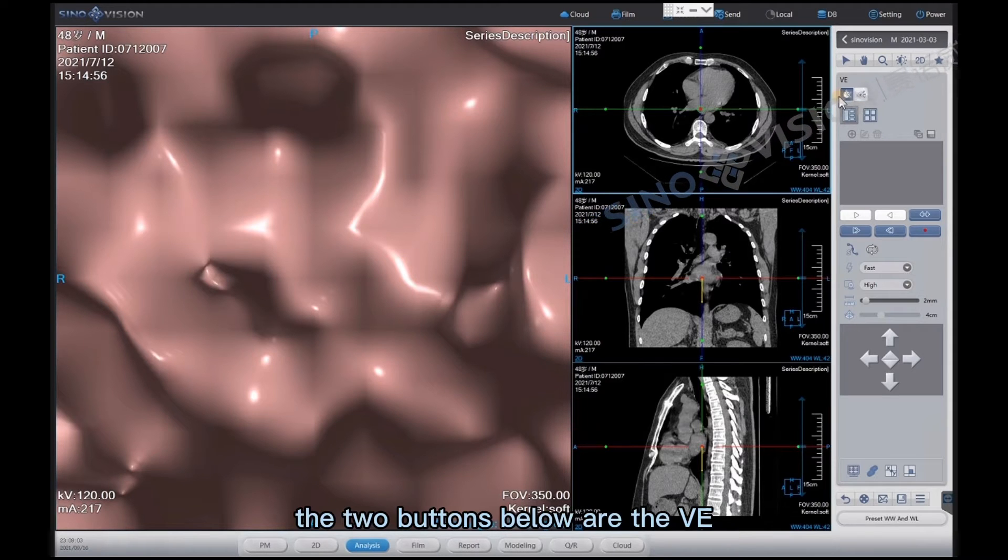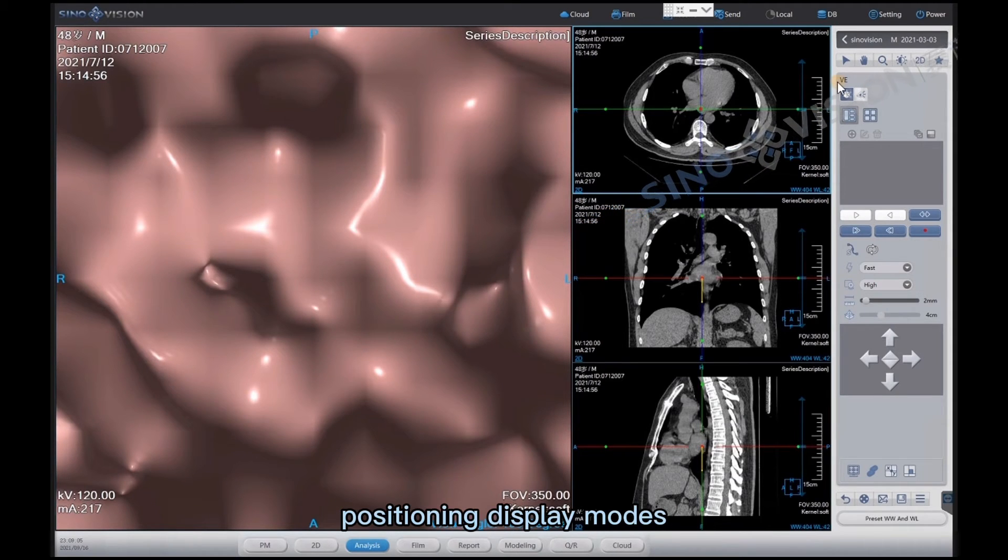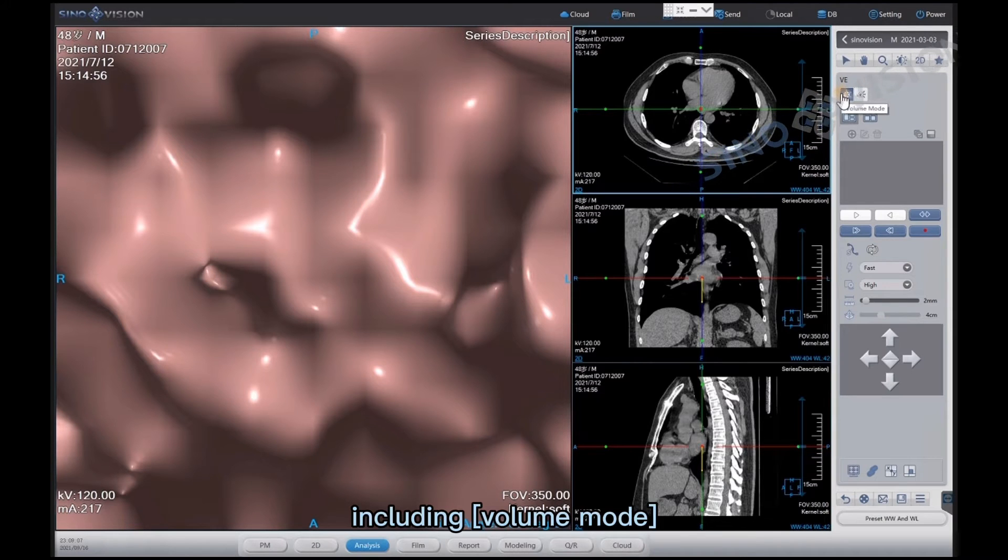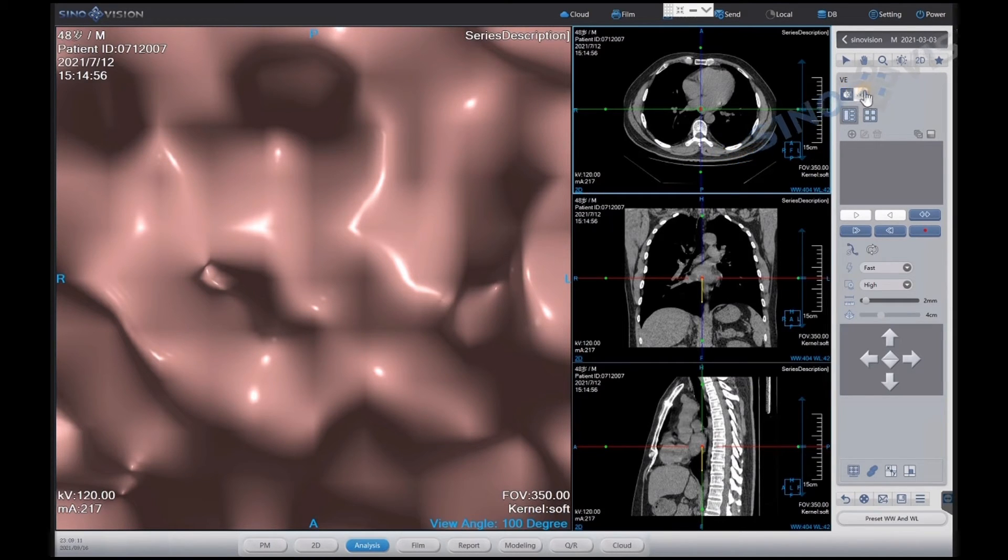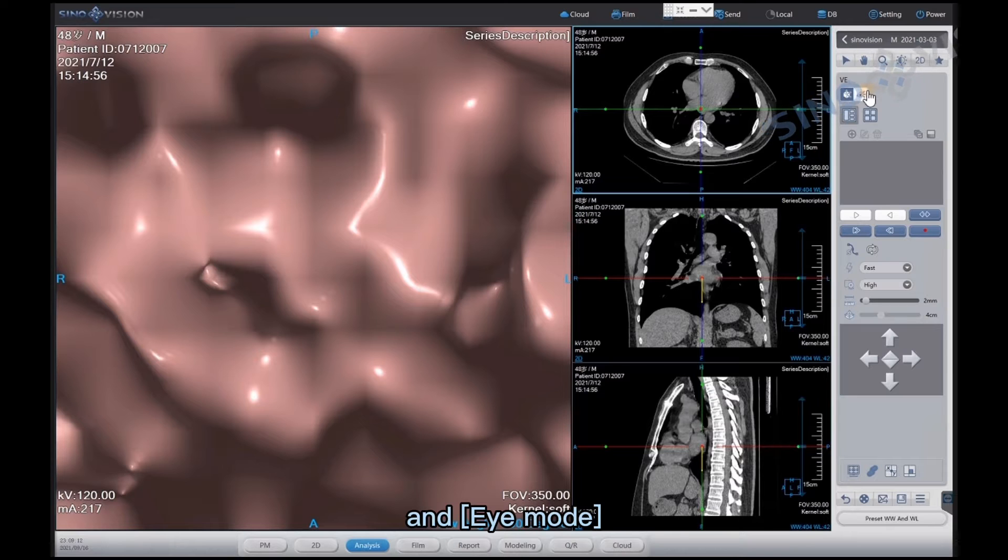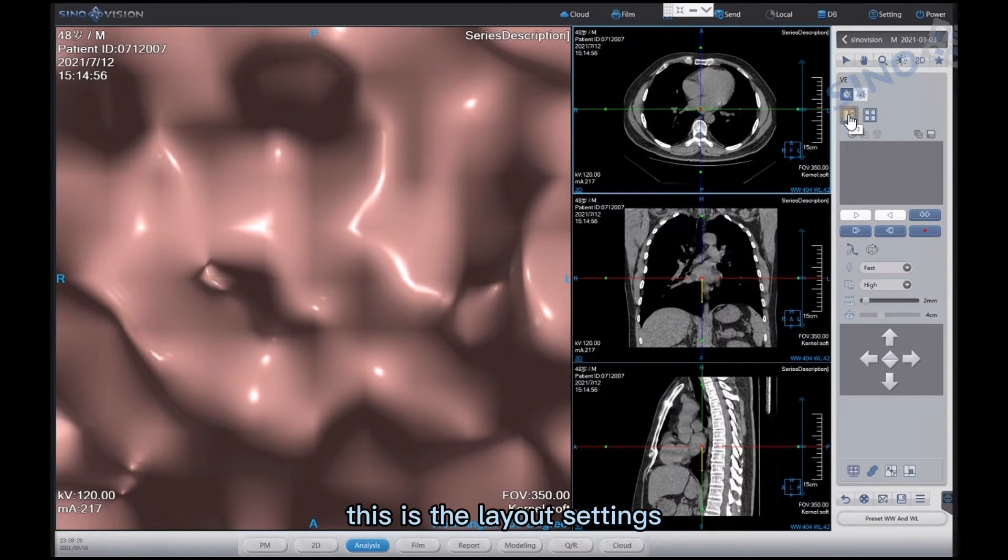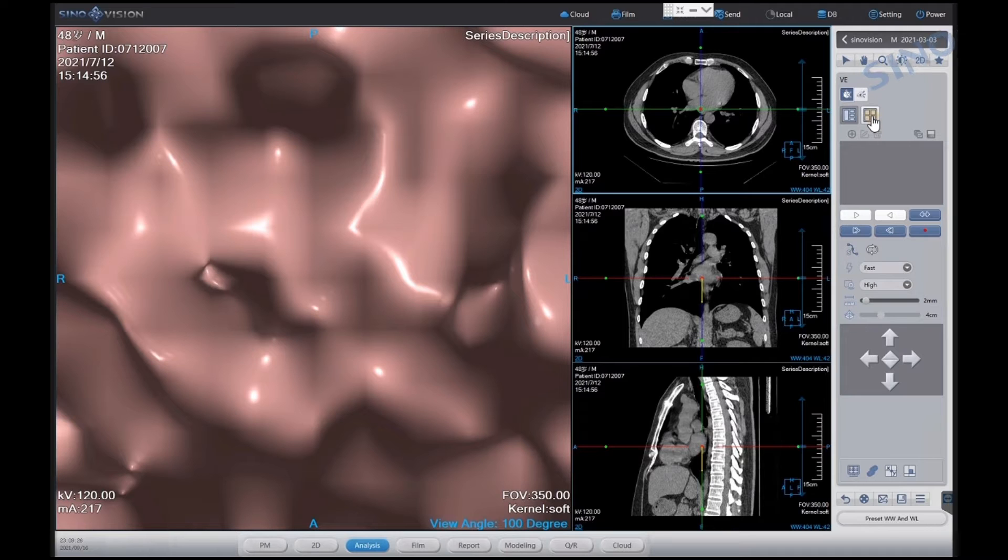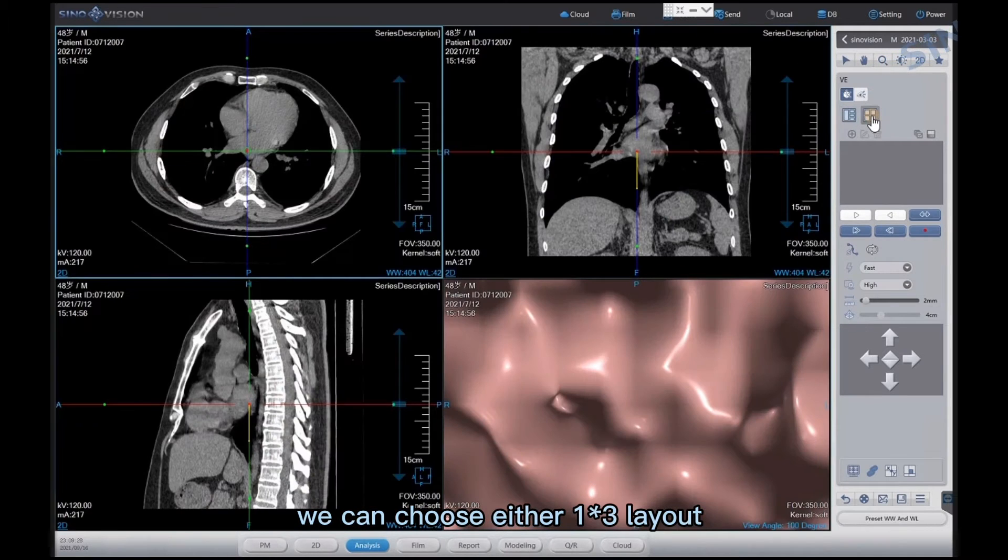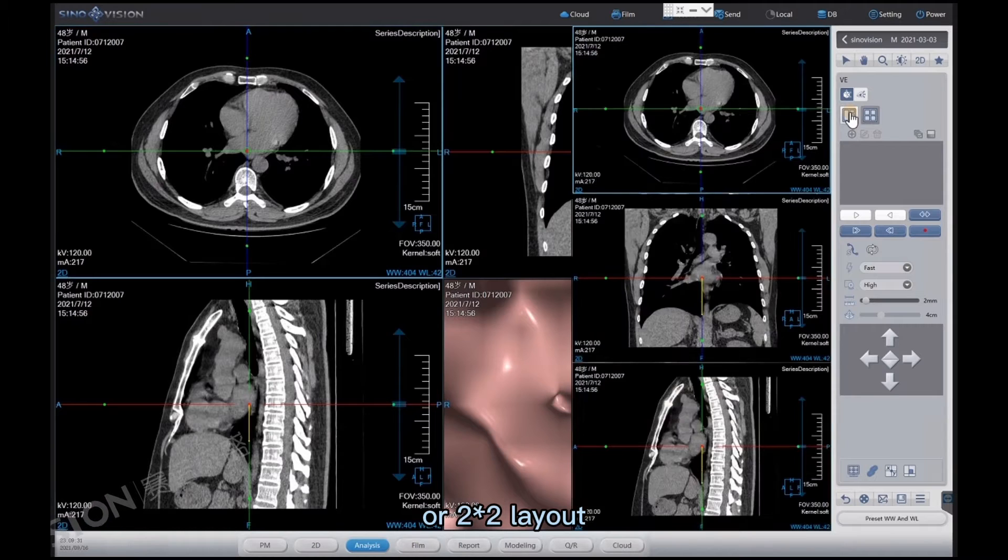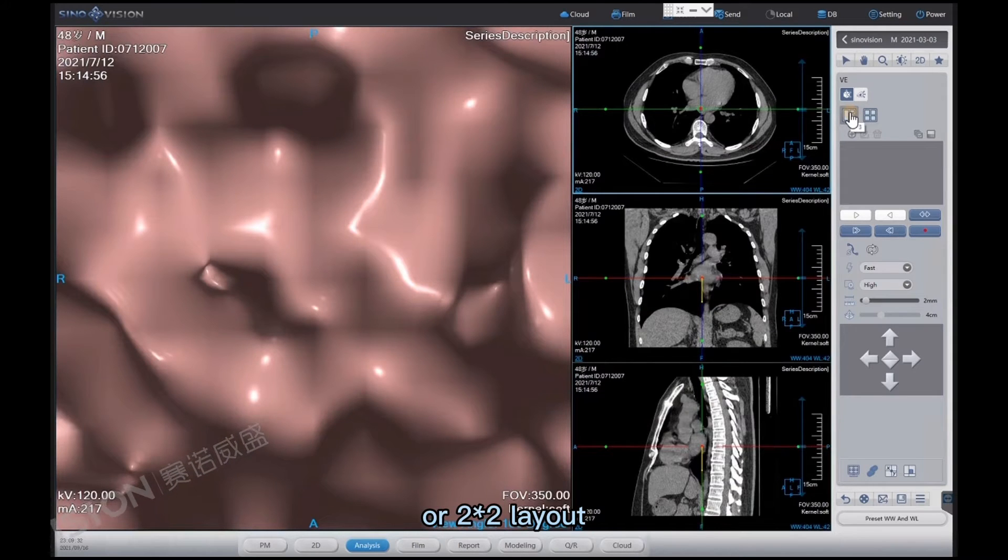The two buttons below are the VE positioning display modes, including volume mode and eye mode. This is the layout settings. We can choose either one by three layout or two by two layout.